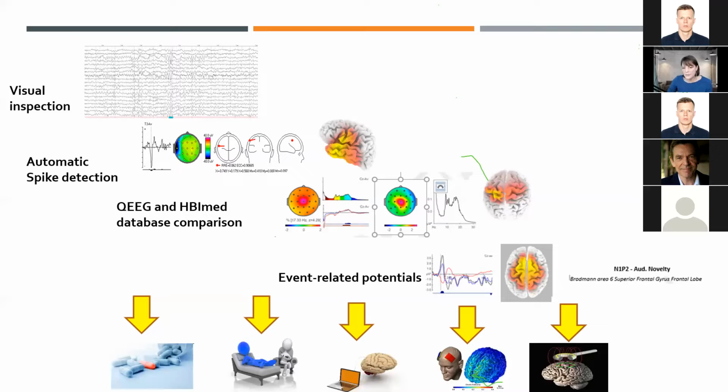Also, some researchers try to understand this phenomenon, and they mentioned that sometimes the temporal occipital abnormalities we see in quantitative EEG can be not because of a physiological reason, but because of the recording style. So some re-referencing can help to understand better if it's really temporal occipital or something else. I don't know if I answered your question.